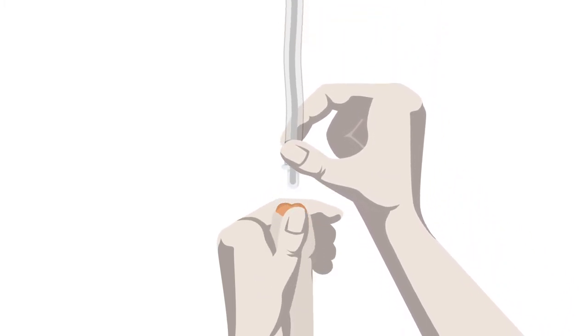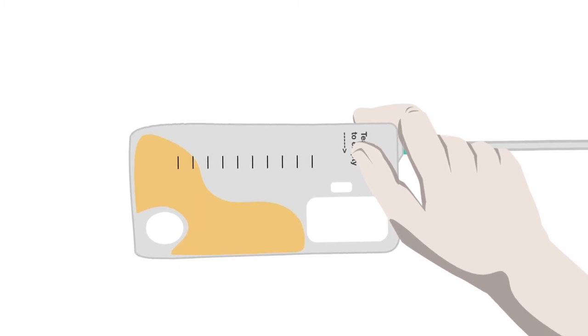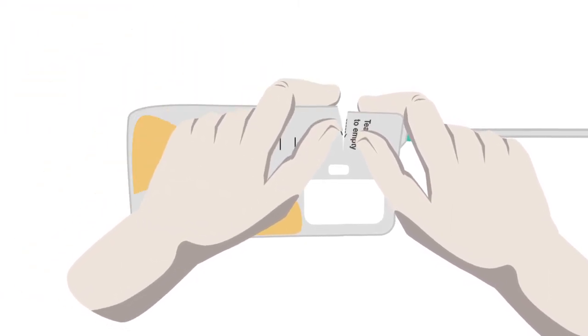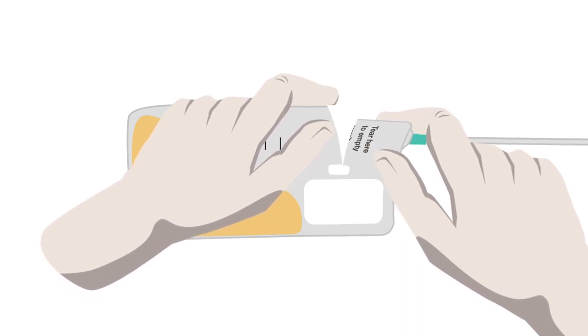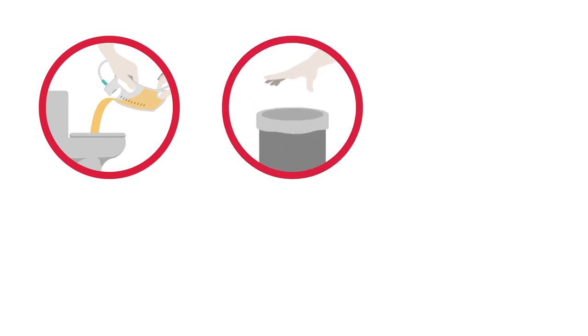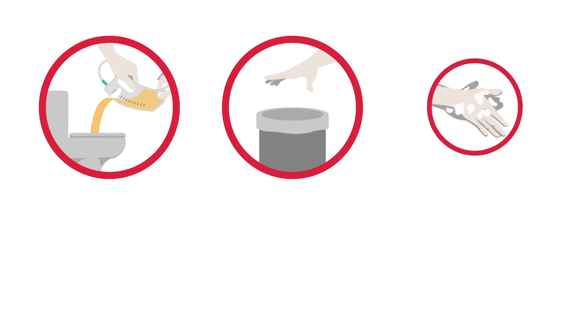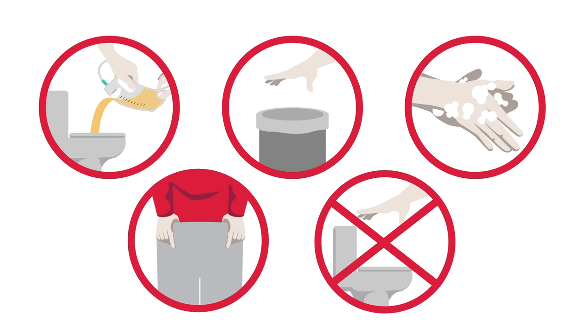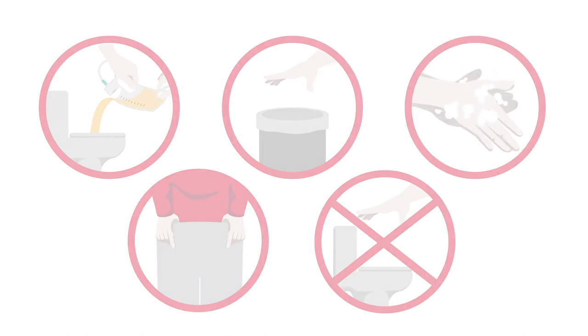Replace your foreskin, unless circumcised. After fully withdrawing the catheter, hold the collection bag by the handle. To empty the bag, tear it at the arrow labeled "Tear here to empty." Drain urine into a toilet or other receptacle. Dispose of the catheter and any other material in a waste bin. Wash your hands and readjust your clothing. Don't flush any materials down the toilet.